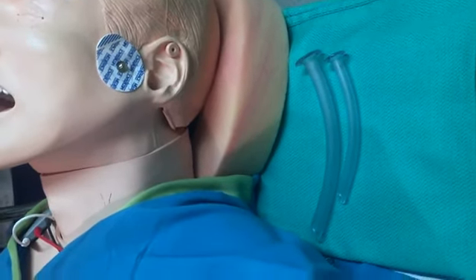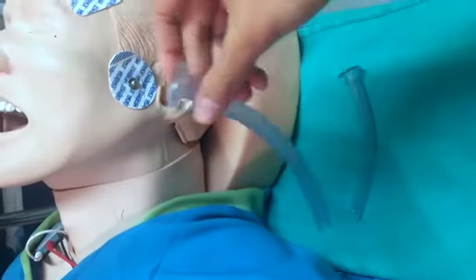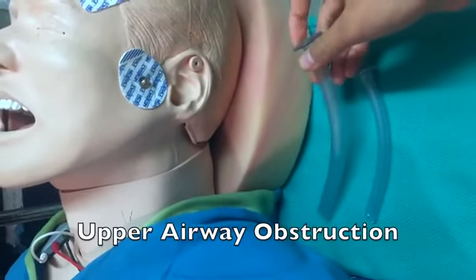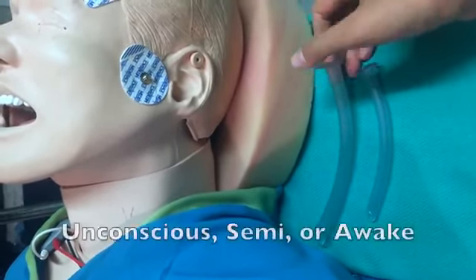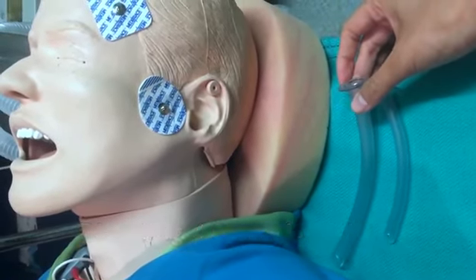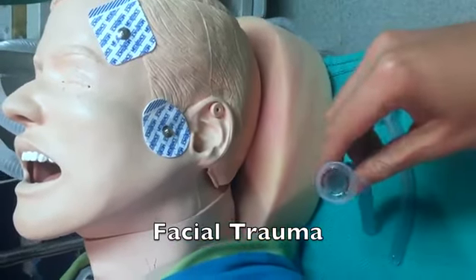Next, I want to talk about nasopharyngeal airways, or nasal airways. They kind of look like this. Some indications for use are an upper airway obstruction where the patient is either unconscious, semi-conscious, or awake; you could use this. There are some potential complications and contraindications of this use. If there's bleeding or coagulopathies, a basilar skull fracture, or facial trauma, it's probably not good to use this.